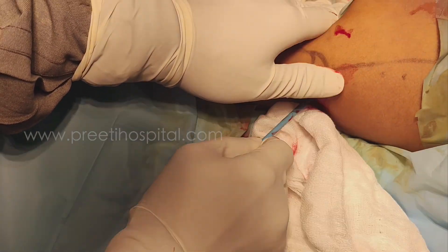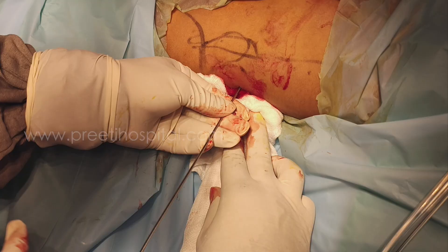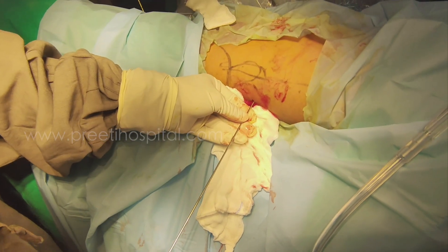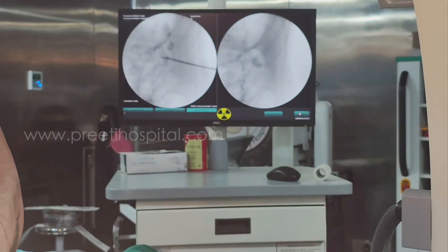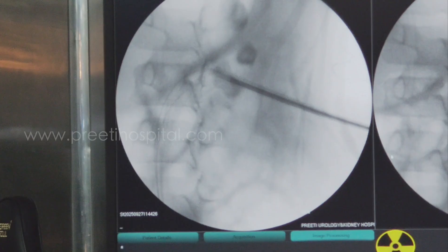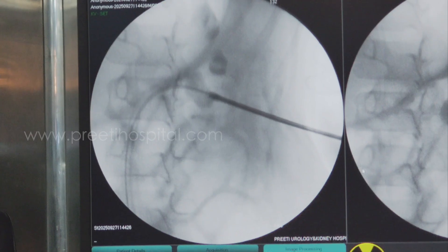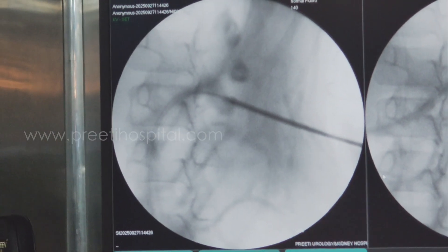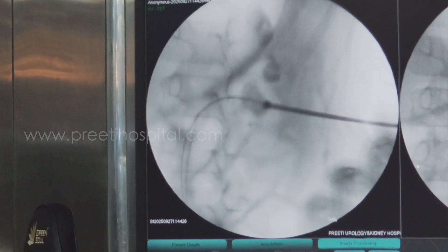I am continuing. I like to inject contrast because I want to see whether it is anterior or posterior. I am not feeling it now — now I am feeling it. It means the entire stone is accessible. Better to dilate the posterior aspect. I have kept it posterior like this — it is safe to keep it posterior, not upward, while doing dilatation.